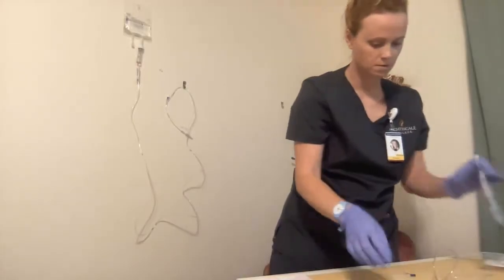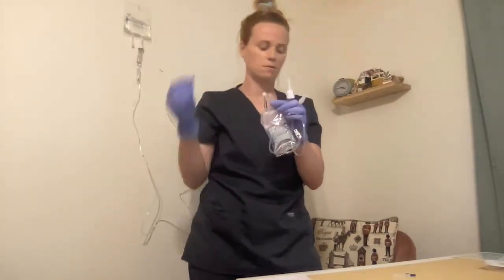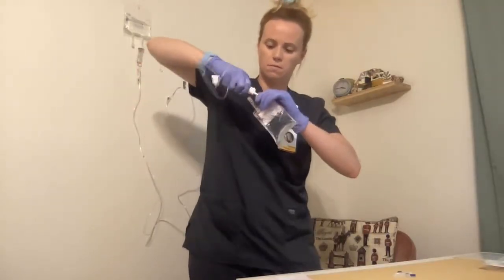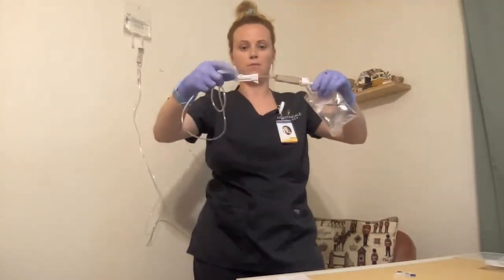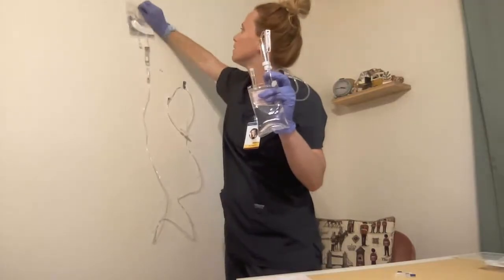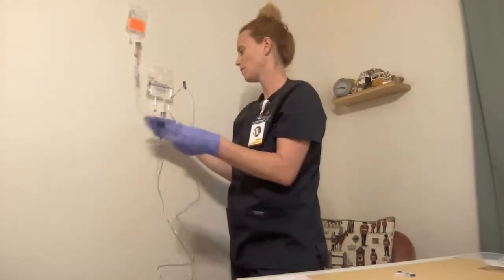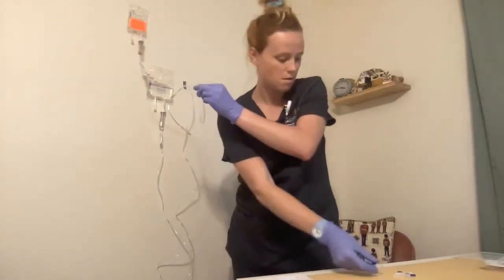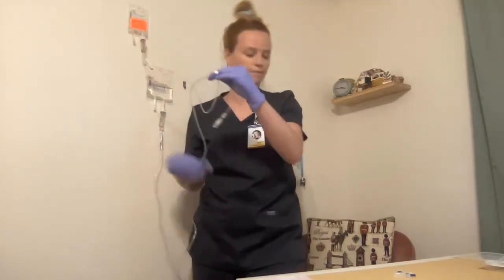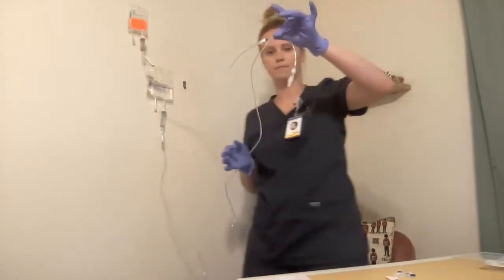Now I'm going to hook up my secondary tubing to the medication for the patient. Same thing — I'll remove the medication bag cap first, then the spike cap, and insert it all the way in. I want to make sure my clamp is all the way down so the liquid doesn't just pour out. Since the patient needs this medication, I want to lower my primary fluid down and hang the medication higher — above the fluid. Then I'll remove the cap on the secondary adapter end, alcohol the Y port so I can connect my secondary tubing, let it dry, then twist on and connect.